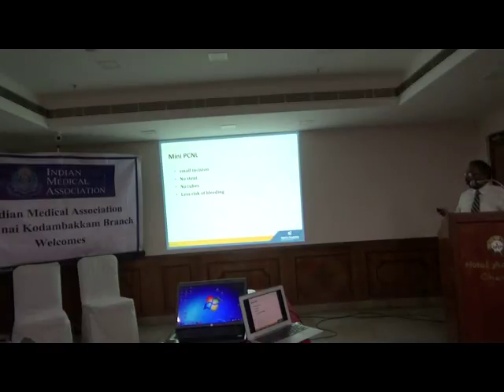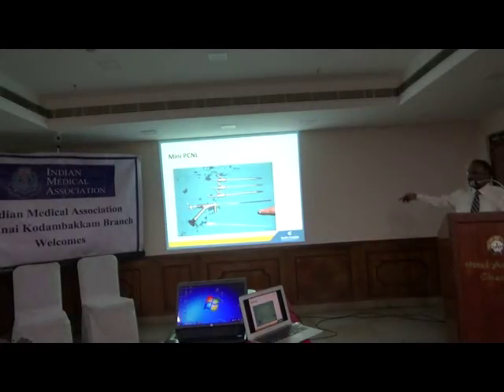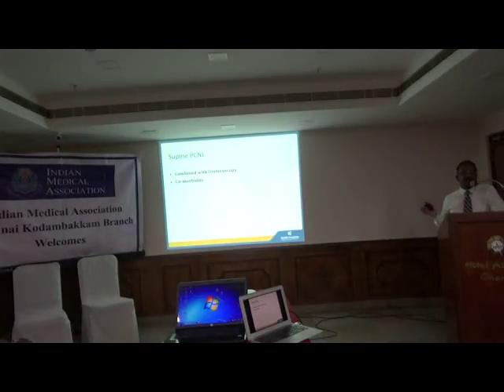So what exactly is a mini PCNL? What we have done is reduce the size of the incision, or reduce the size of the sheath. This is an instrument which you use nowadays, and it comes in three types: small, medium, and moderate. This is the instrument we use. So what is the advantage of mini PCNL? The first thing is a smaller incision, so the bleeding risk is much lower.